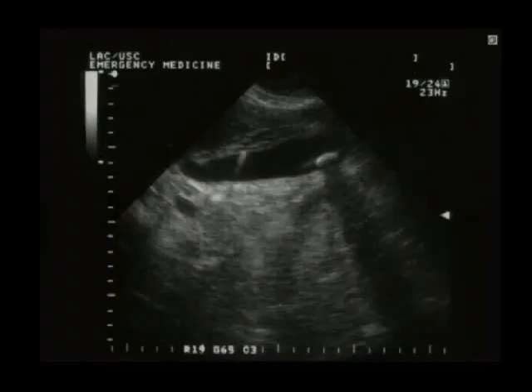Here's a patient that we scanned. This is the right upper quadrant. You can see the gallbladder. You can see a large stone right here. But I also want to show you the wall here. See this wall here? This is the gallbladder wall.